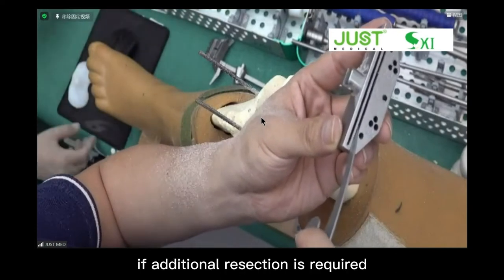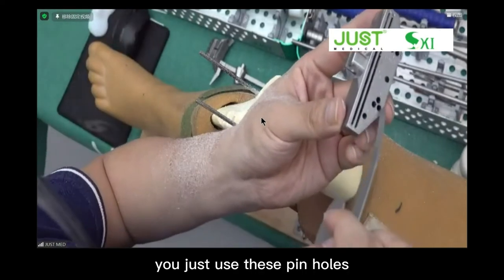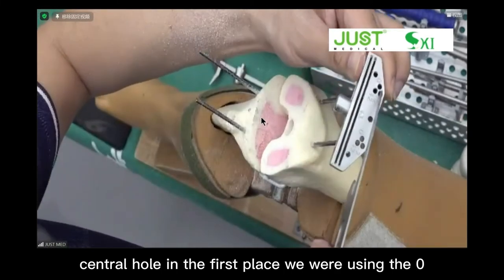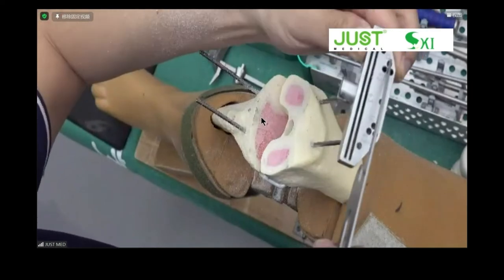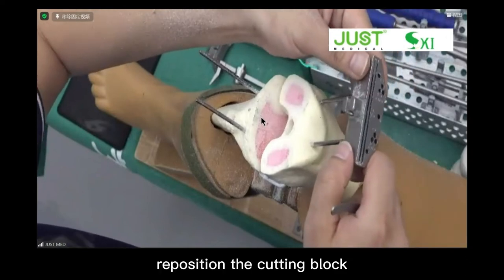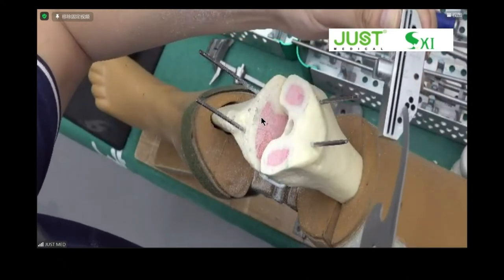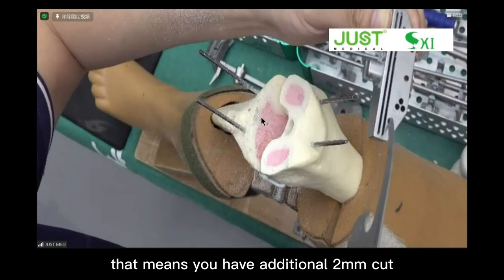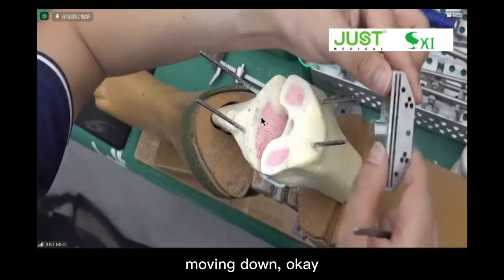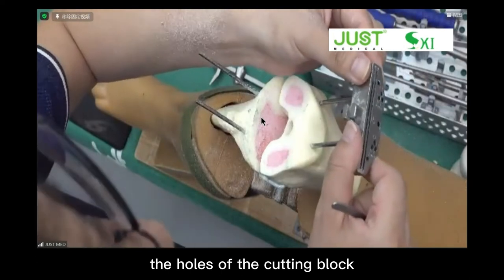If additional resection is required beyond the plus 3 millimeter slot, you just use these pin holes. For example, in the first place, we were using the central hole, the 0. You can remove the block and reposition it to make the pins go through the plus 2 holes. That means you have an additional 2 millimeter cut because we are moving down. We just leave the pins in place and change the hole of the cutting block. Then you get more resection.